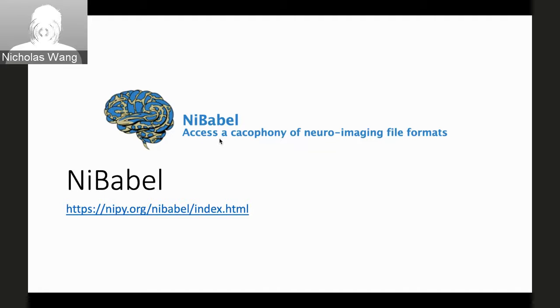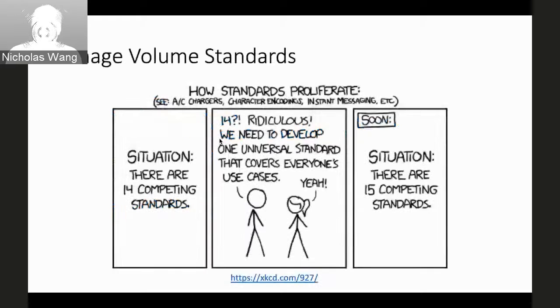And if not, I'll go on to Nibabel, which is a package for handling a lot of these different imaging file formats, and contains a lot of the utility functions for these neuroimaging files. And so you might say, DICOM standard is great, and you could think of it as one of the image volume standards, but beyond DICOM, and once people start thinking, oh, maybe I need to actually handle images as a volume, you start running into issues.